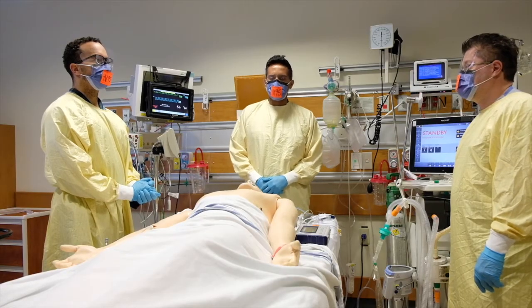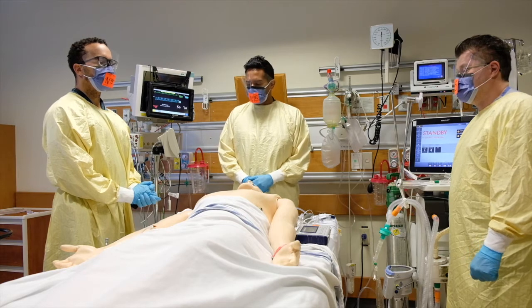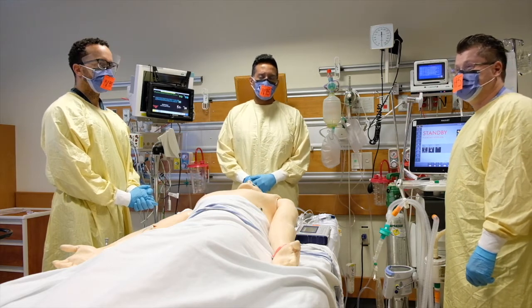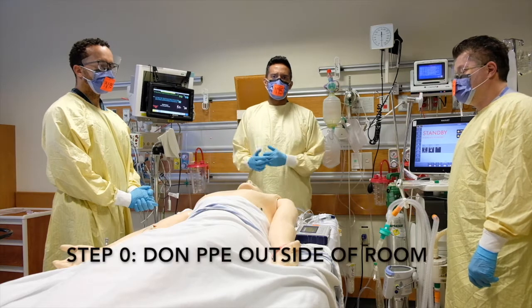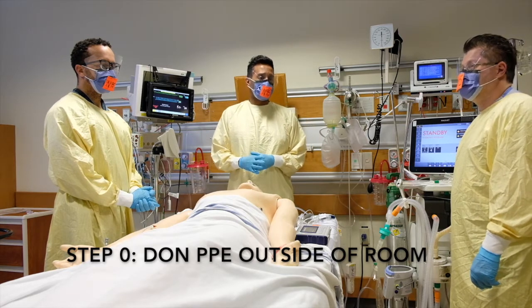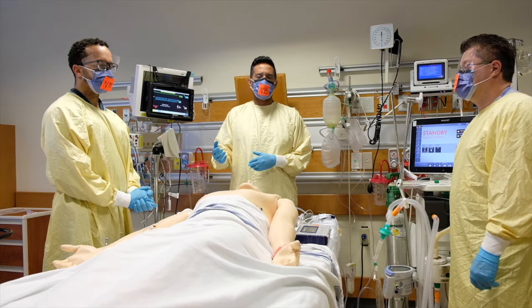Hi, we're one of the teams from the University of Alberta Hospital CICU, and we are going to be modeling and simulating how to intubate a patient that is either COVID-19 positive or potentially COVID-19 positive. As a first step, you can see that absolutely everyone in the room is fully gowned with proper donning technique. I will refer to previous videos that have donning for more reference on that.